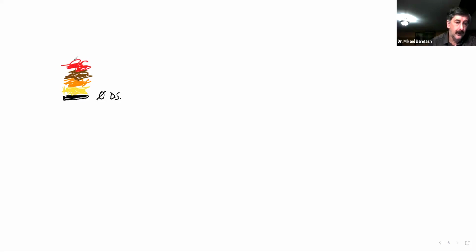Clear? Since this is not inverted, all these colors, what would they represent? Positive Doppler shifts. On the other hand, we can say this and this and this, and lastly this. These are all negative Doppler shifts.